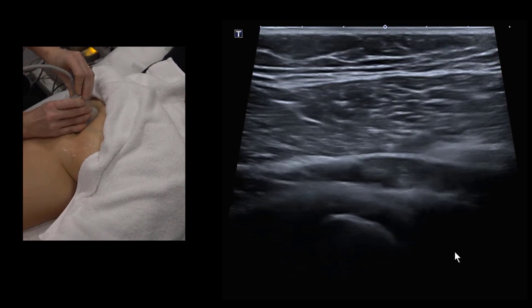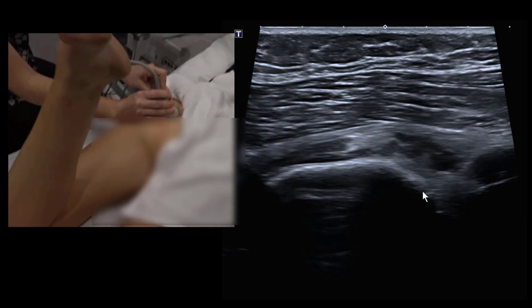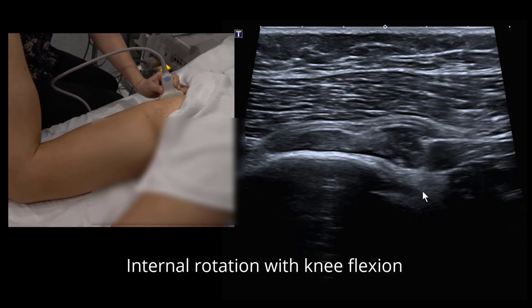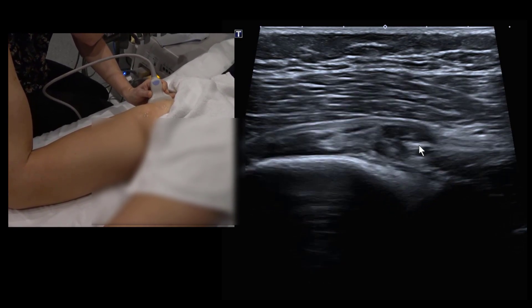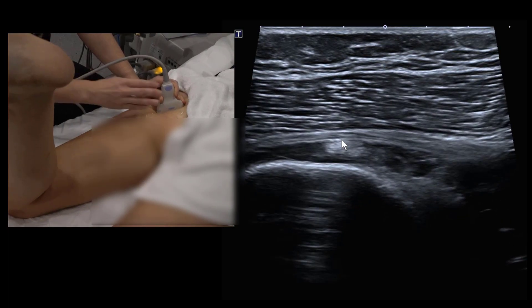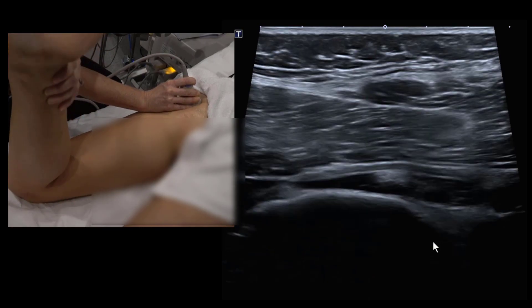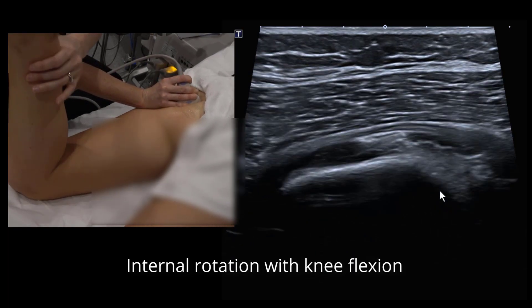Now we look at the sciatic nerve in dynamic movements: ask the patient to flex at the knee, then perform internal and external rotation. In simulated internal rotation, the sciatic nerve develops natural angulations — one between inferior gemelli and quadratus femoris, and another at the obturator internus level. In simulated external rotation, the nerve straightens out. Some degree of angulation at these levels is quite normal and also happens in asymptomatic patients.